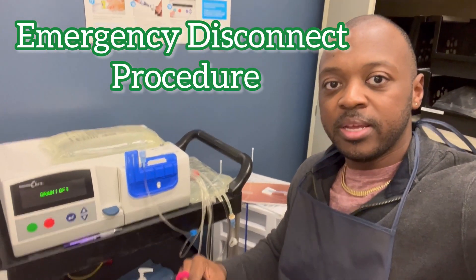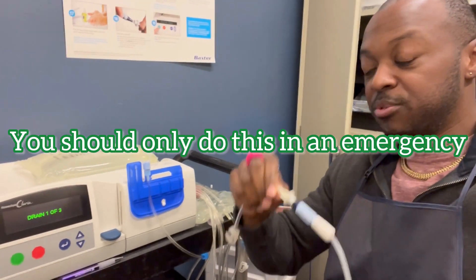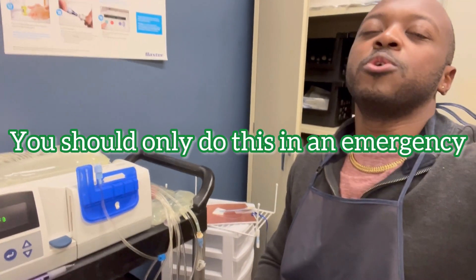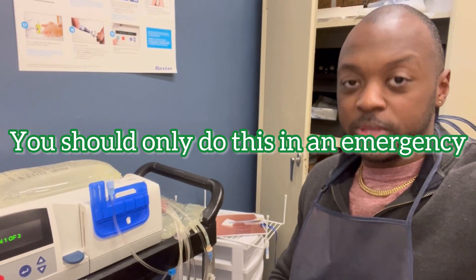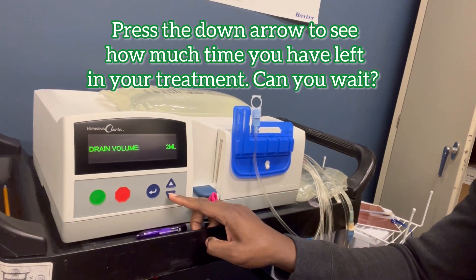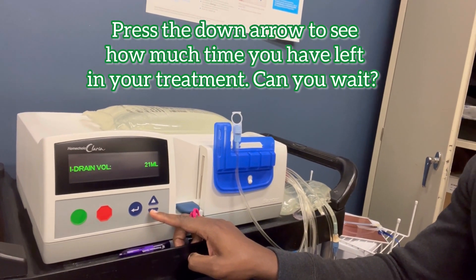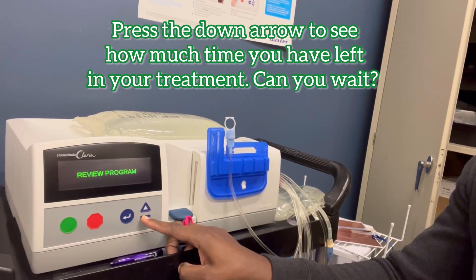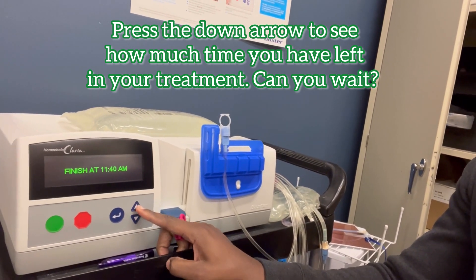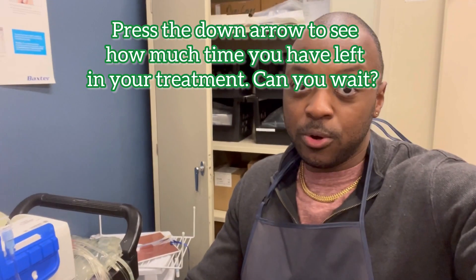Right now I'm on treatment. The machine is doing drain one of three. I am connected to the machine and I really, really need to use the bathroom. My treatment finishes at 11:40 and it's currently 11:04. I cannot hold this — I really have to use the bathroom. What am I going to do?